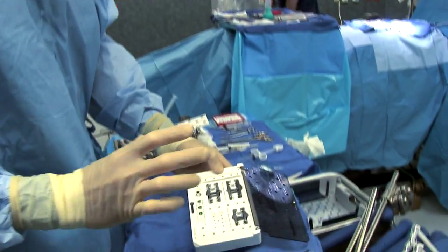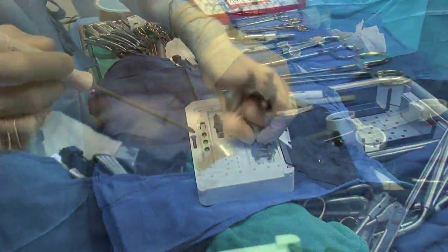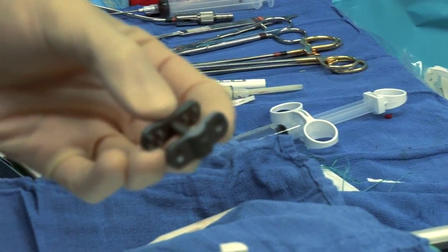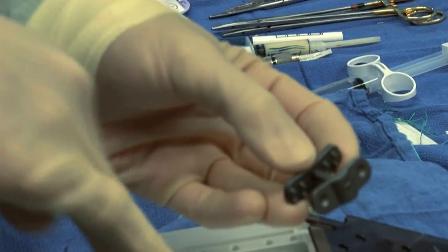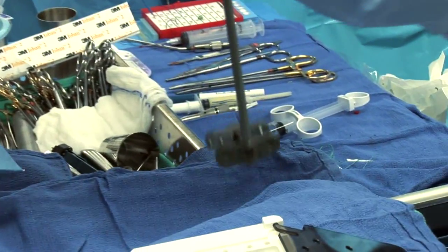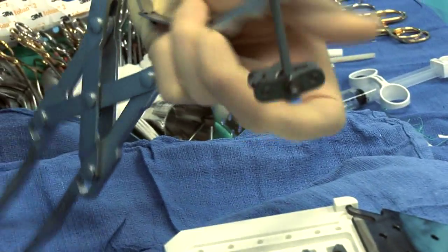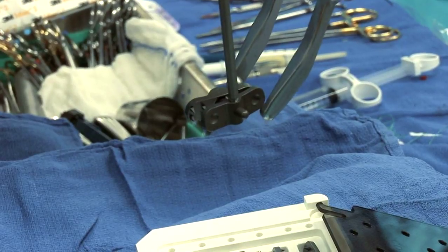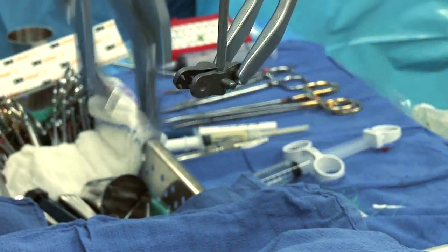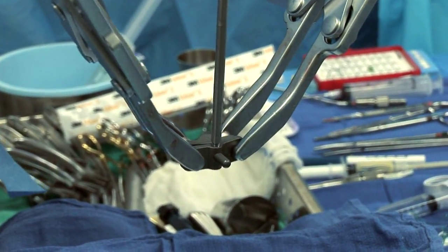What an interspinous device does is clamp onto the spinous processes to secure them and create a tension band. With the patient on his or her belly, we'll make a small incision, open down to the spinous processes — those bones that you can feel in your back. We take out the ligament between the two vertebrae we want to secure together, then simply drop the device down into position. We loosen the nut securing it, and with a set of crimpers, crimp it together on the top and on the bottom, then tighten the lock nut and you're finished.